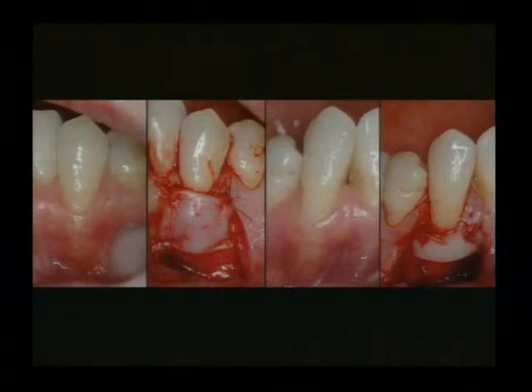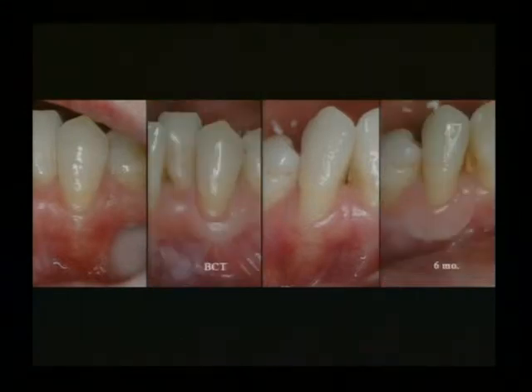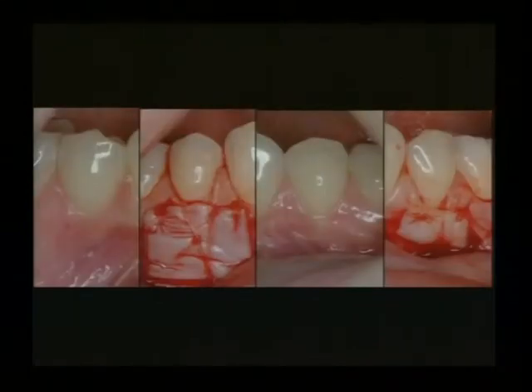Before the bilayer cell therapy, before the free gingival graft. Very equivalent zone of keratinized tissue with the bilayer cell therapy. You can see it's resisting muscle pull. And then the last one I'll show you again, bilayer cell therapy, free gingival graft, and the endpoint.